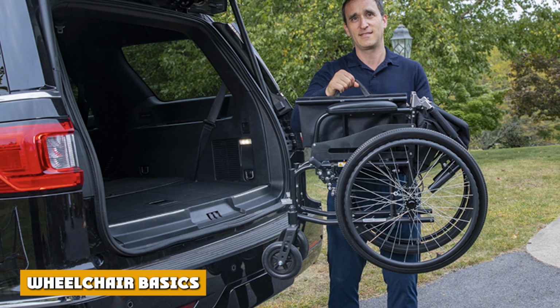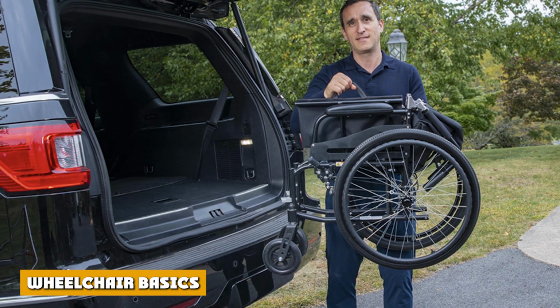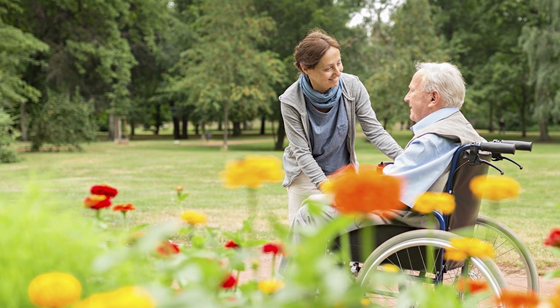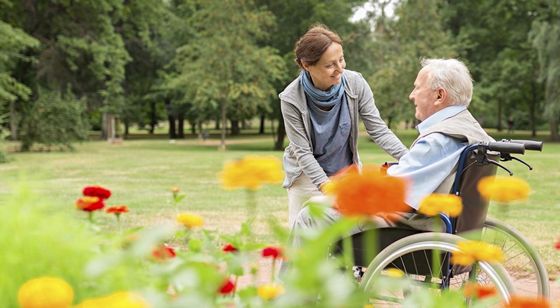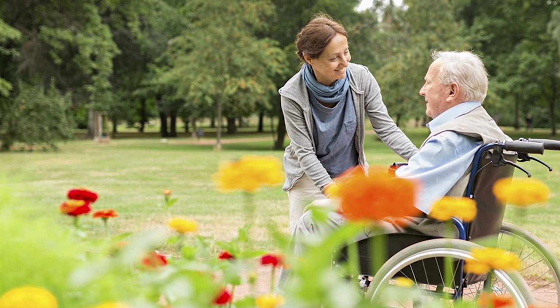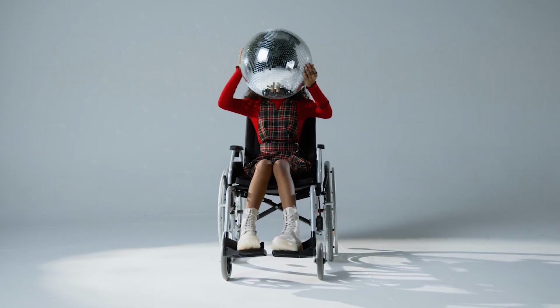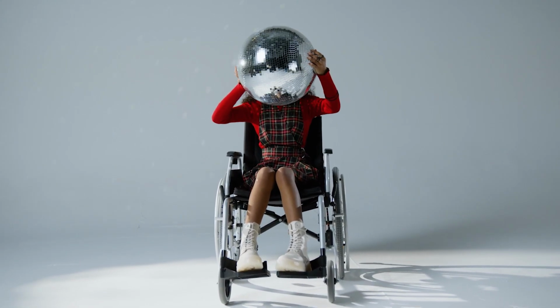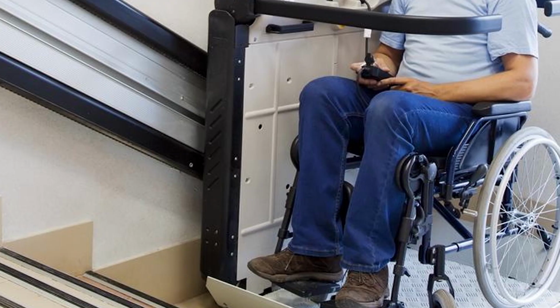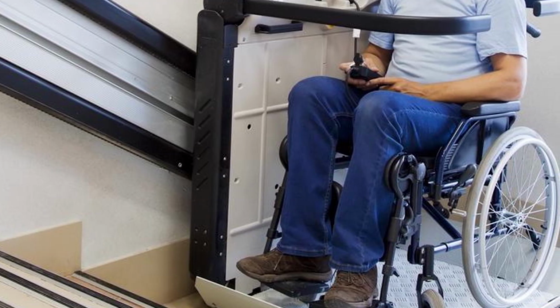Wheelchair basics. A wheelchair is a specialized mobility device designed for those who cannot walk or have difficulty walking unaided. They come in an array of sizes, colors, and designs, but all wheelchairs share a common frame. The front wheels tend to be smaller and are ordinarily attached to a freely revolving mechanism so they can be turned with ease. The wheels at the back are generally slightly larger and are accompanied by rotating handrails. When these rails are pushed, the chair moves forward.